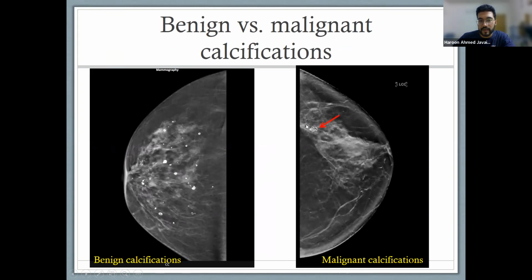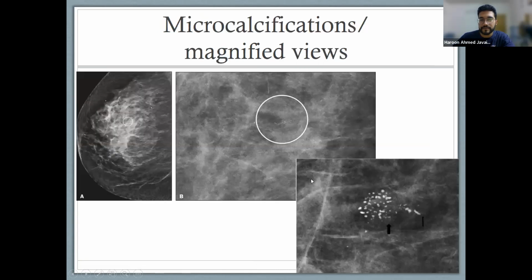Basically you would see them very close together, and it would look like a spiculated mass, which basically means it has irregular edges and it's really nasty looking. So this, as you can see, is denser, it has irregular edges, and then you see that there are focal points of a lot of small calcifications, okay? So this is generally going to be a breast cancer, and this is the image that you should be most aware of. Okay, next you have microcalcifications.